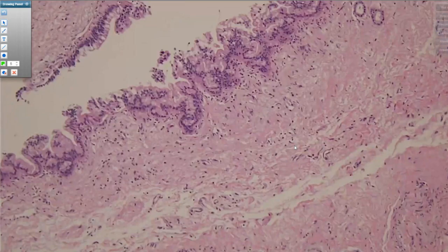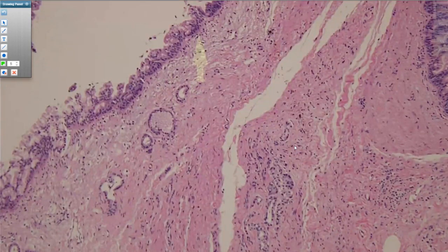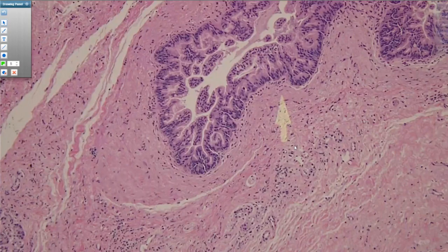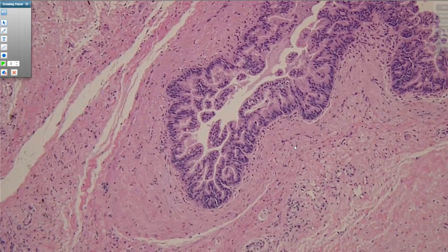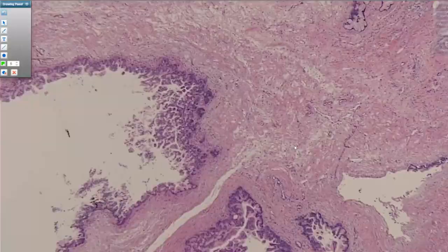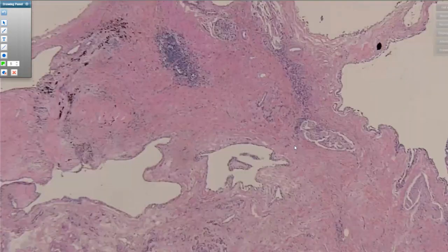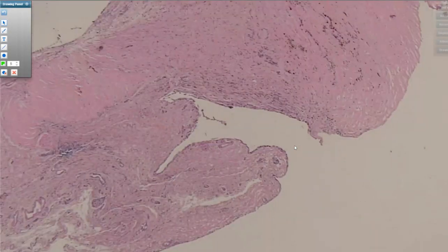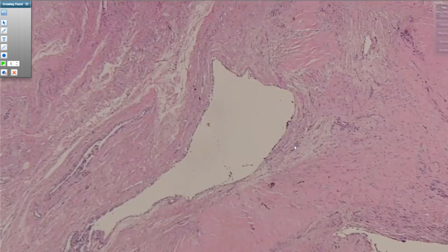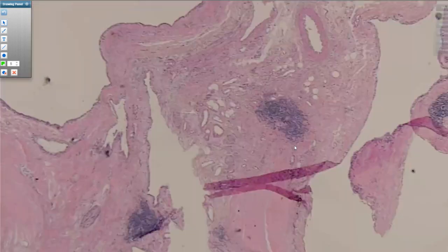As we take a look at the stroma underneath this cyst, most of it is variably hyalinized, and you have some areas that are a little bit more cellular. They look like very small, thin spindle cells, more like fibroblasts. You never get a dense area of really plump spindled cells like you would see in true ovarian stroma. In this particular case, this lady had a main duct IPMN that was causing the dilation of her main pancreatic duct, and it was just a collision with this serous adenoma that happened to be sitting next door. They're not related, they're not really involving the same spaces, because the serous adenoma doesn't involve the duct system. They just happened to be sitting next to each other.